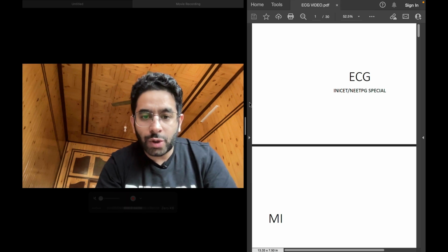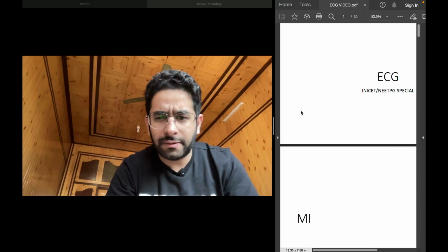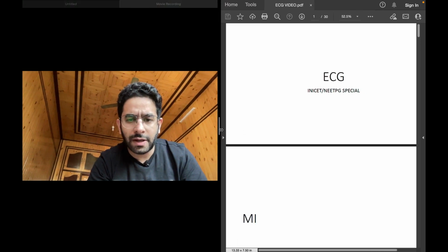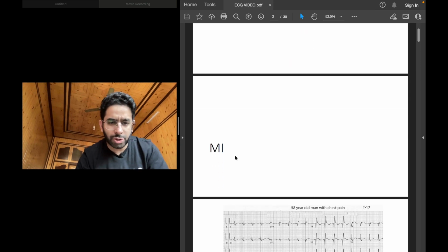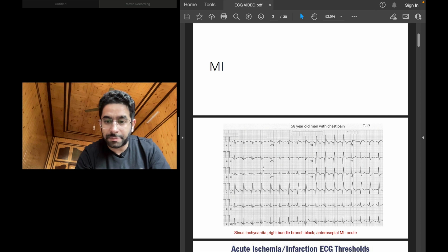Okay, so I'll discuss them. Slightly lengthier video than my routine videos. So I have divided these ECGs into different parts. So I'll be starting with MI, which is the most important ECG that you need to know. I made dedicated videos on that separately.